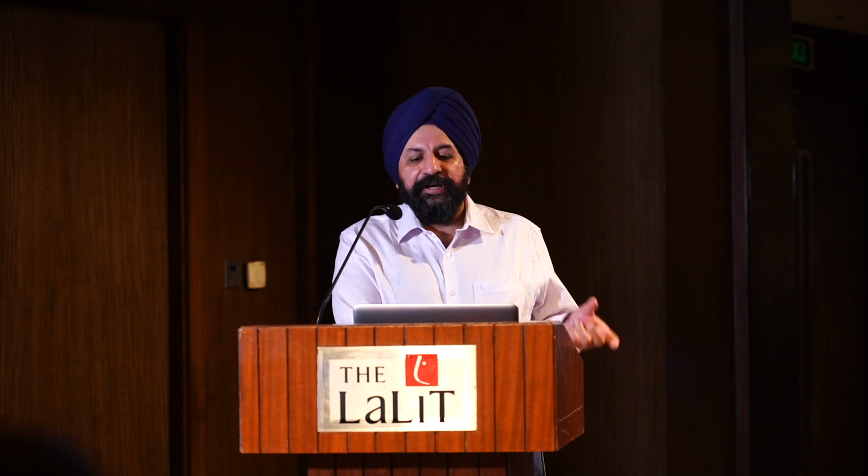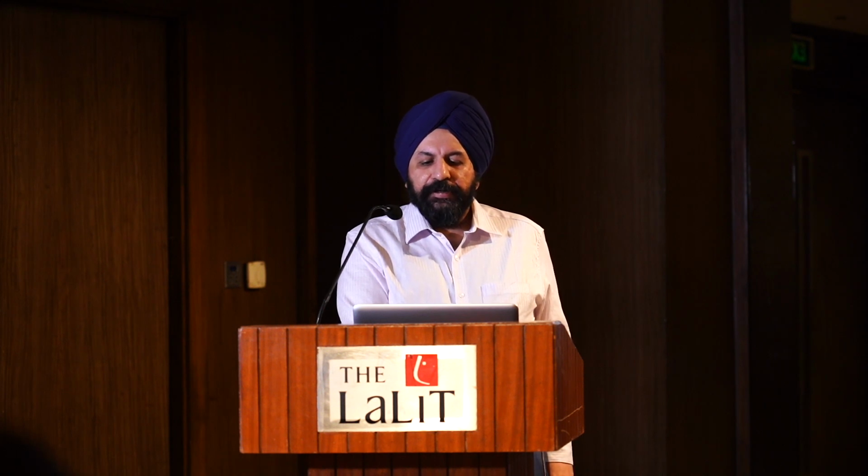Then this is our second paper. We tried to compare two analyzers, BC 6800 Mindray and Sysmex XN 1000, to look whether the IPF from the two analyzers correlated. So as you can see, the IPF R value overall was 0.960, and for less than 6 it was 0.972 and more than 6 it was 0.901. So it was showing good correlation between the two analyzers. I'll skip this. This is another prize that we got.